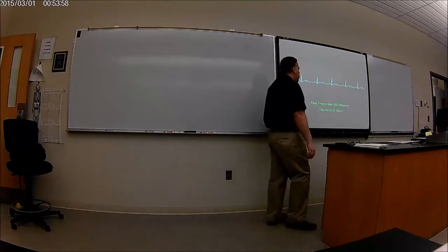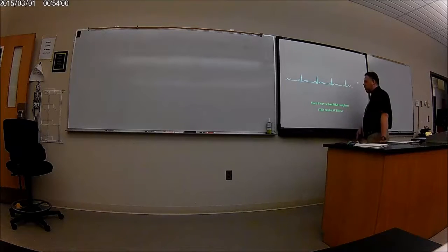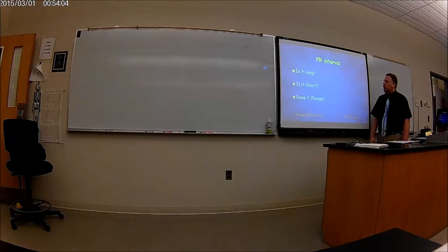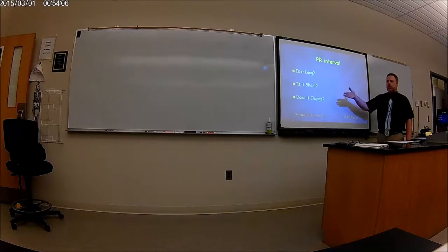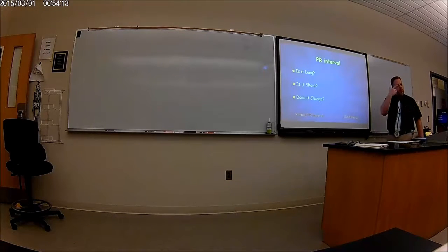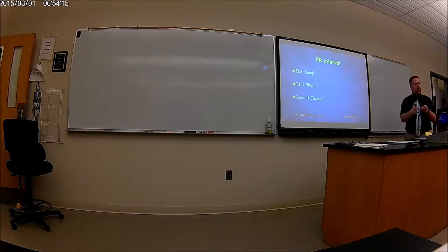Okay? There's more P waves in this, just so you can see it compared to the QRS. You would ask yourself, I wouldn't ask you this, but is the PR interval long, is it short, does it change at all? These are the kinds of questions that go into your head as you look at it when a doctor or a nurse practitioner looks at an EKG. This is what's going on in his or her head. Is it normal or not?